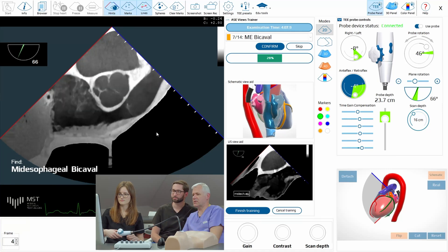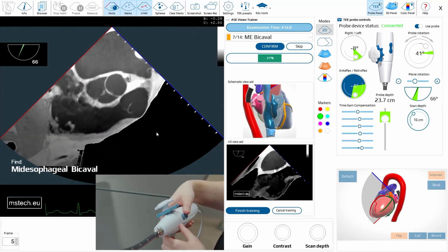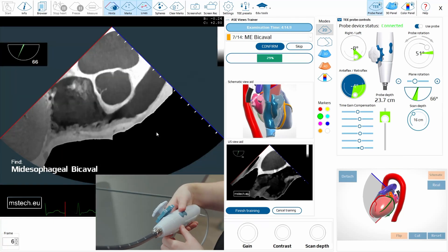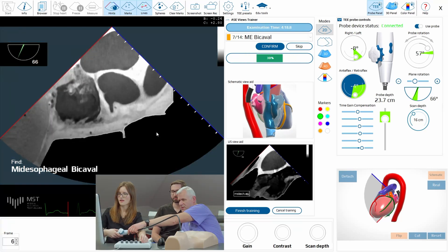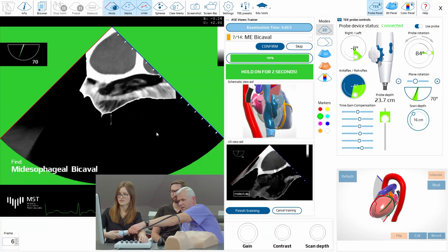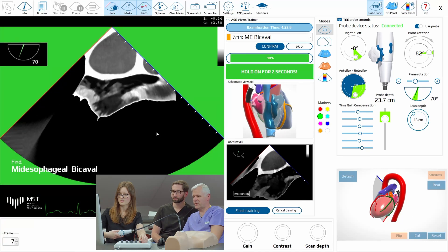So now the bicaval — bicaval already. So now we should increase the angle slightly and go right. Angle, okay. Good. Right cable.